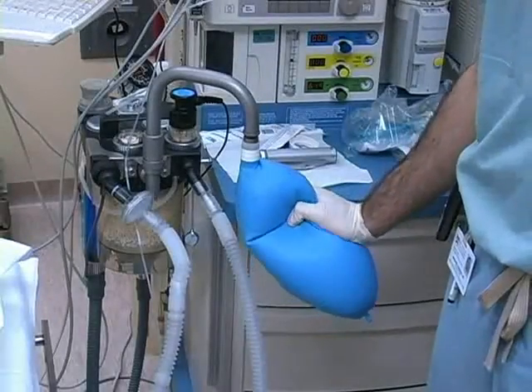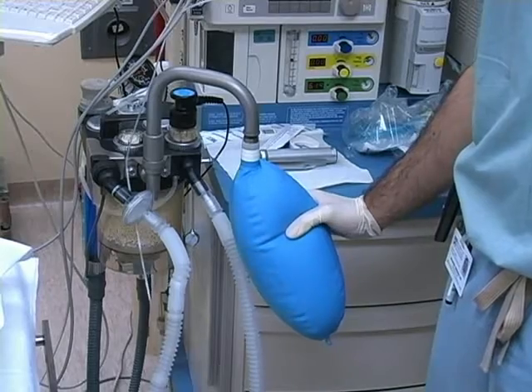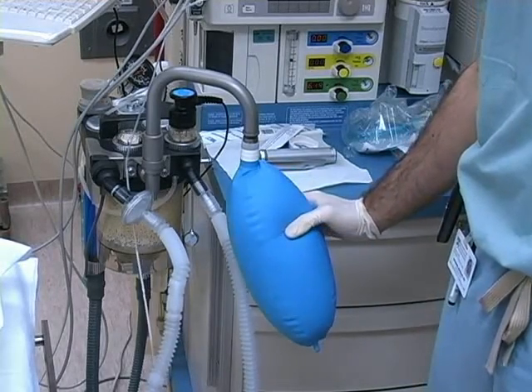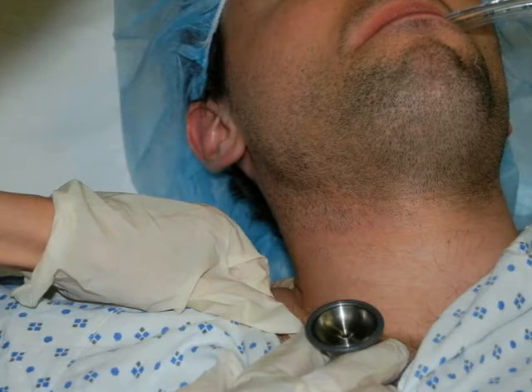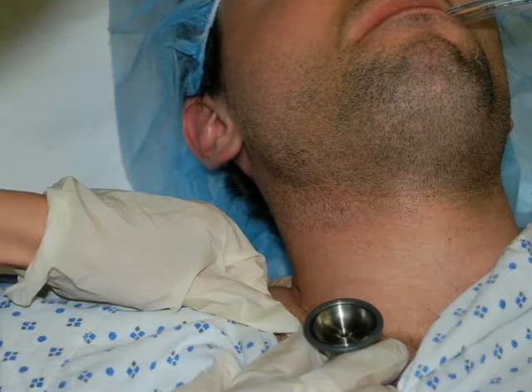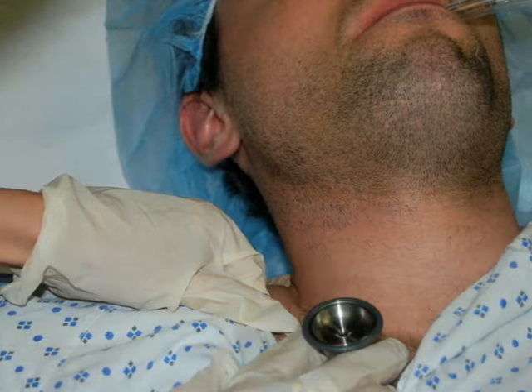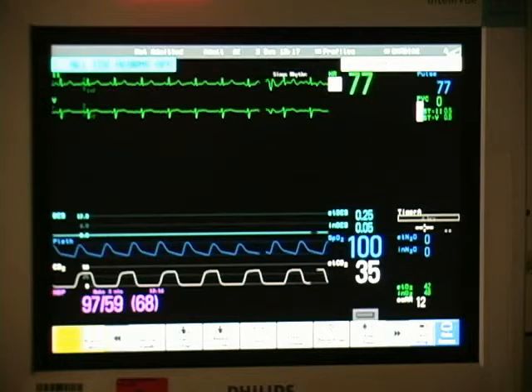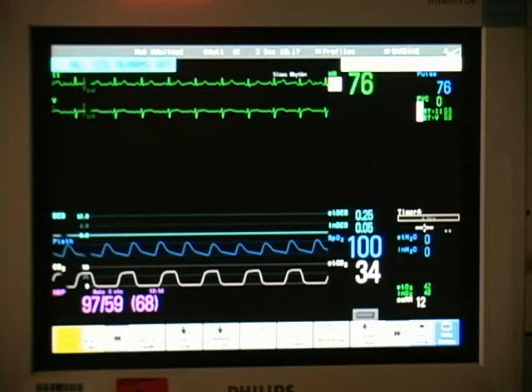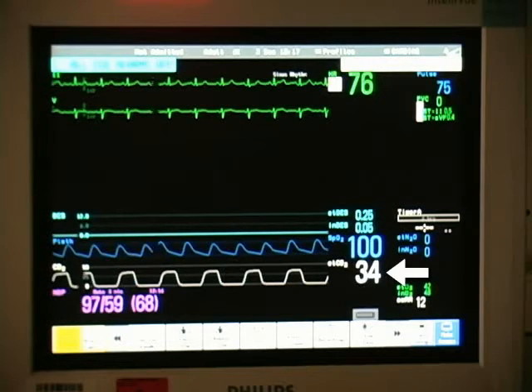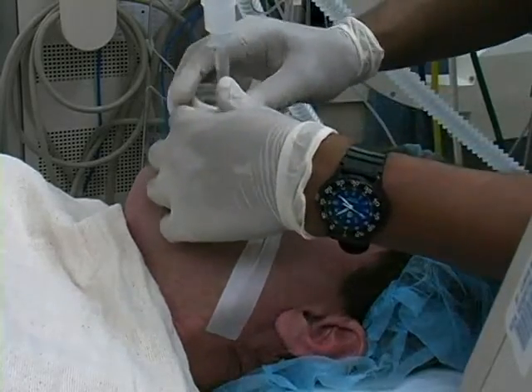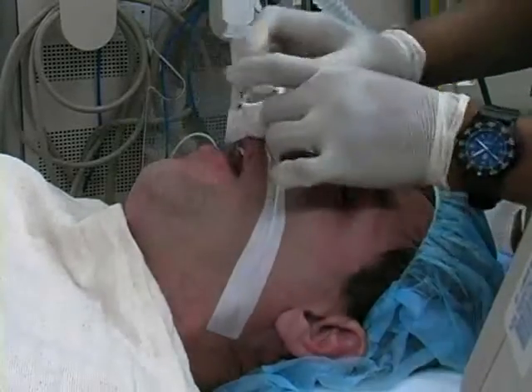Provide a gentle breath with the reservoir bag, not to exceed 25 cm of water pressure. Confirm successful ventilation by watching for chest rise and auscultating the lungs bilaterally. Verify ventilation by checking the monitor for the presence of end tidal carbon dioxide. Secure the tube with tape.